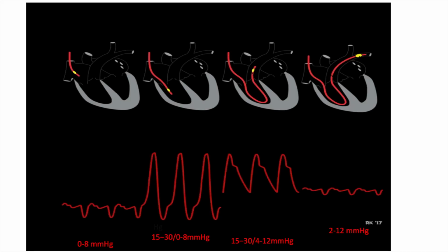So you have to insert the pulmonary artery catheter till the mark of 20 centimeter. When you advance it till the mark of 20 centimeter, it will reach the right atrium, and you will see this waveform. This waveform is identical to the CVP waveform, where you see the three peaks A, C, V and two descents X, Y. Normal right atrium pressure is 0 to 8 mm Hg.